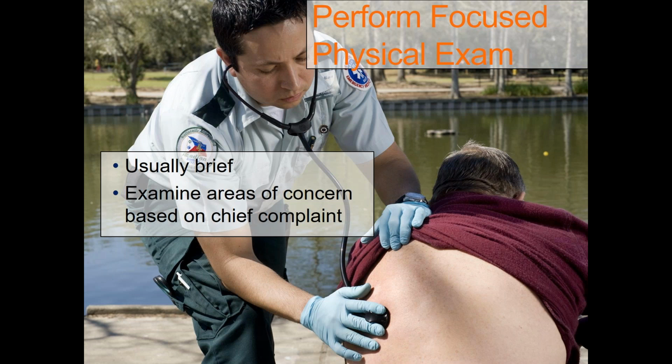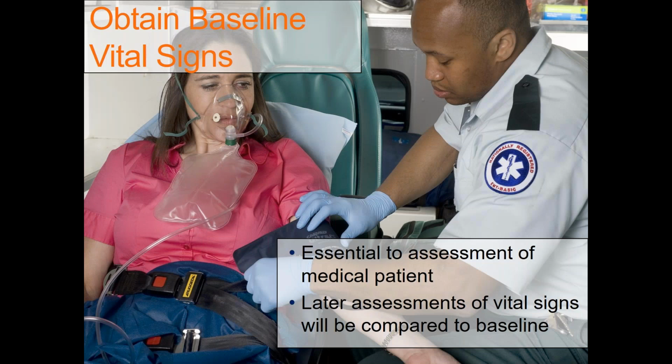Your focused physical exam is also going to include your vital signs, because the next thing we're going to do at the end of that is obtain our baseline vital signs. Baseline meaning the first set. It gives us our jumping off point. We're going to compare any downstream or any later sets of vital signs to that baseline set.